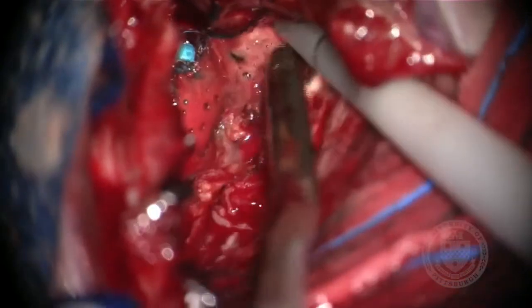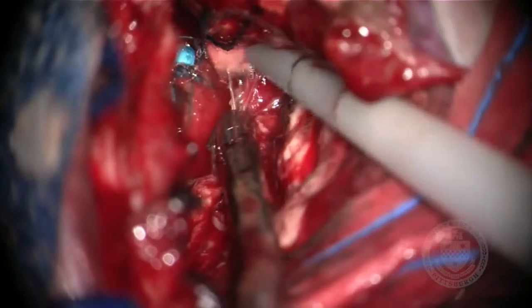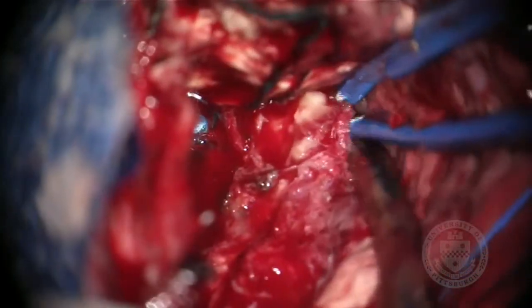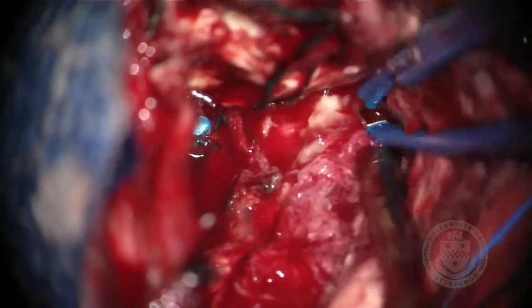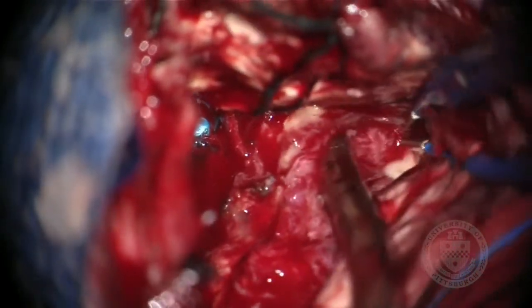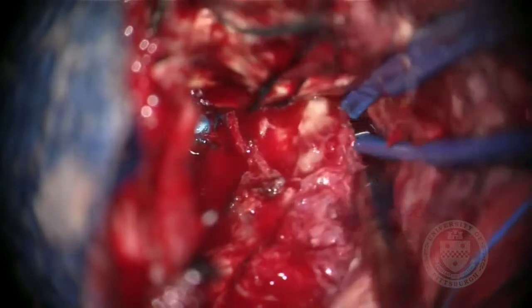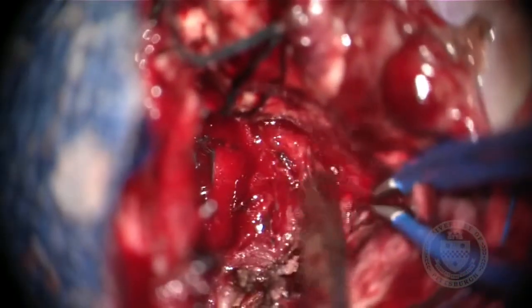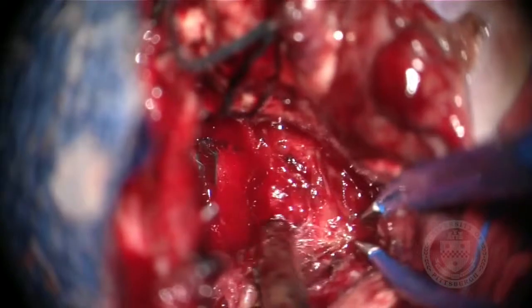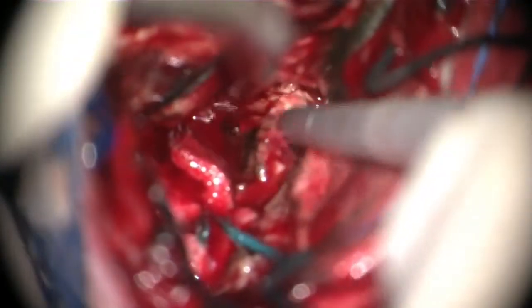Once we expose abnormal tumor, we continue debulking of tumor with the ultrasonic aspirator. We keep following the choroid plexus within the ventricle to the anterior aspect of the temporal horn. This defines better the tumor mass that has to be resected.